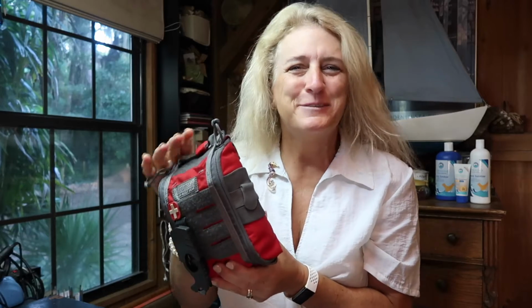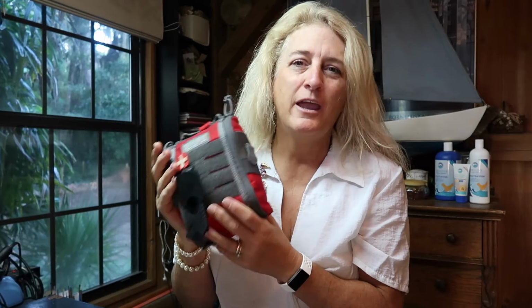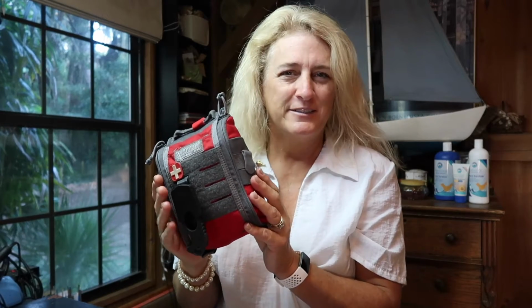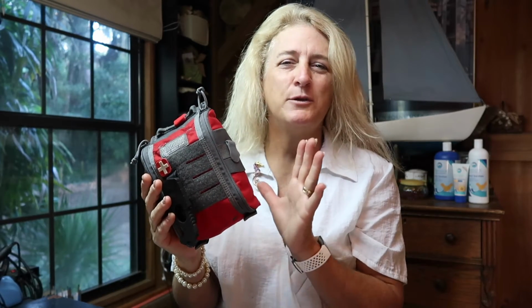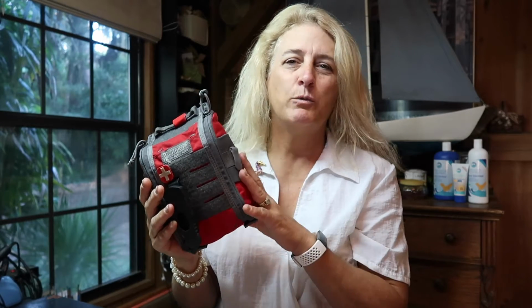Good morning. This morning I'm going to show you exactly what I carry in my bleeding control kit that I carry every day on the boat with me. My backpack is red. It's an Osprey backpack so that everyone can see where my bag is, because not many people carry a red bag, so that they can easily identify where this kit is located.